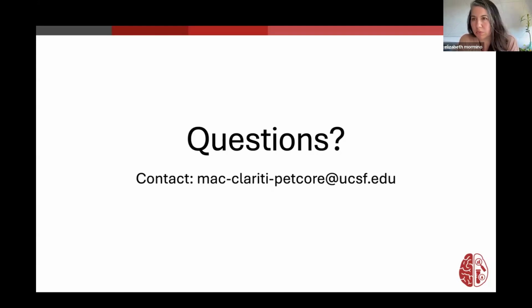As we're waiting to see if anybody has a question, there was one question posted earlier, which I think has been addressed. The question was, which consent do you use if you only return amyloid PET results, but not tau PET at this time? As Gil reviewed, tau PET disclosure isn't included in CLARiTI at this time. So the tau PET piece doesn't influence the consenting process. The only option with disclosure, if you're within CLARiTI, is the disclosure of amyloid PET information.